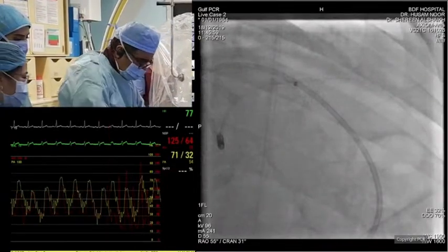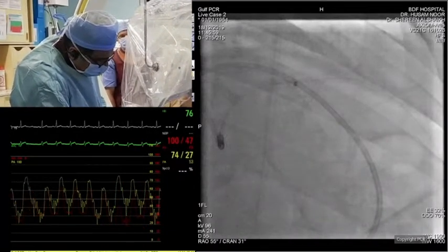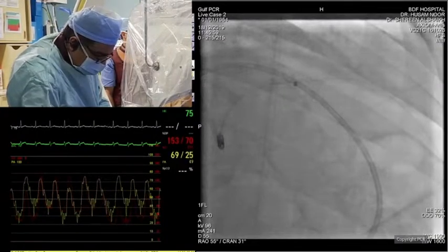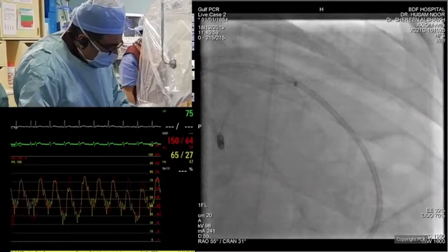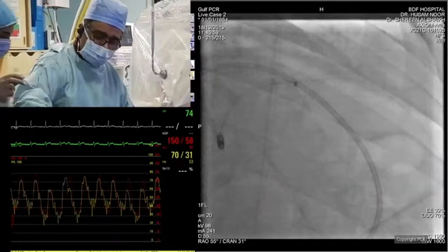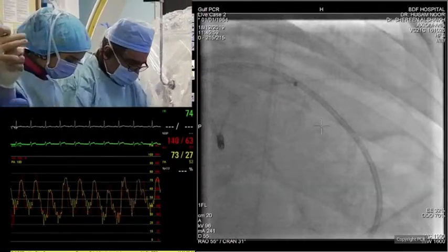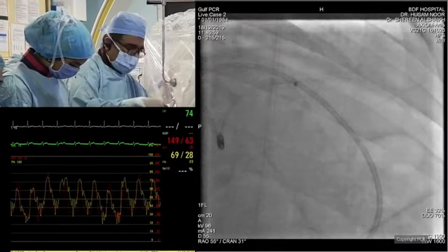So you got the guide liner within the stent? In our practice, anybody with low EF is high risk. We tend to do the right heart study, and we have a low threshold to put an Impella. But not because we used to overuse the Impella before, so I don't want to overuse the Impella. Yeah. So if I see hemodynamics like this, I can proceed. But if any chance that things are not going well, we can immediately put an Impella.